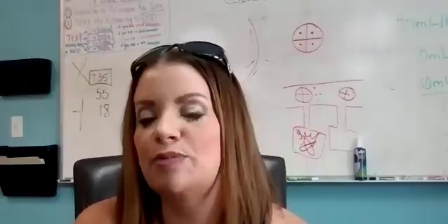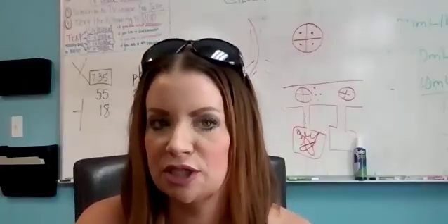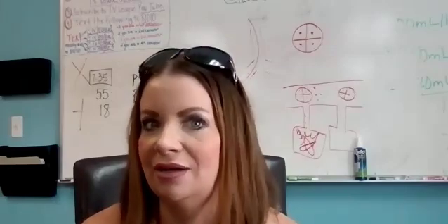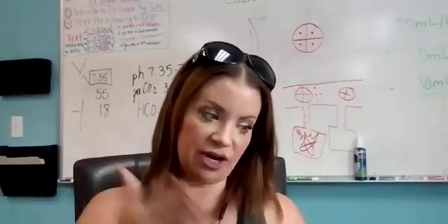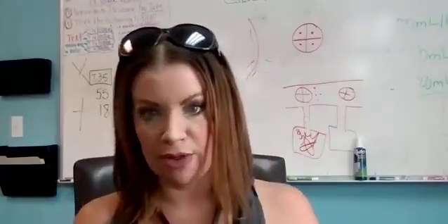All right, so we will use BiPAP with early ARDS. What is ARDS? Acute respiratory distress syndrome. It's basically a very generic term to say your lungs have had it. This is very bad. So we will always try non-invasive before invasive. We don't want to ventilate any of our patients because they have so many complications.